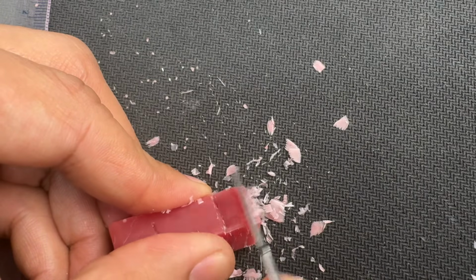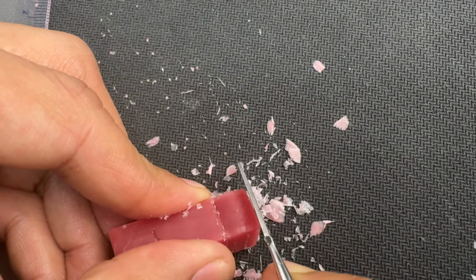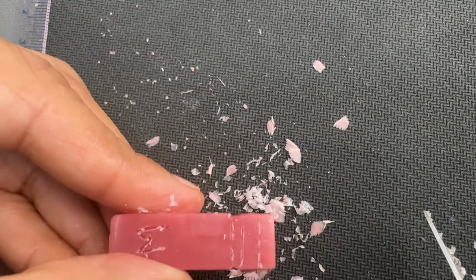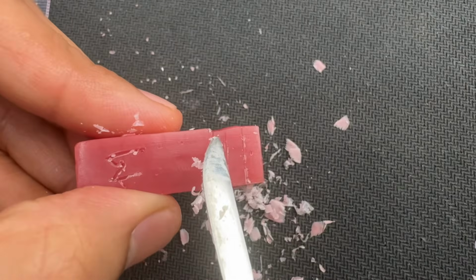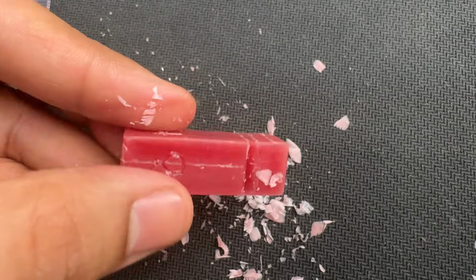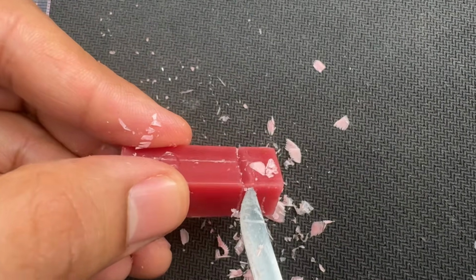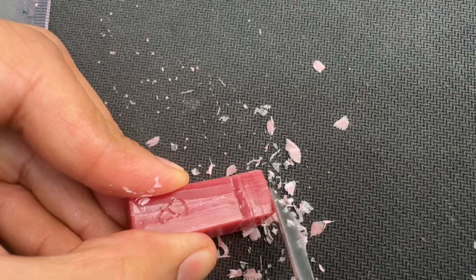As you do, make sure the surfaces are smooth and even and don't create any concavities. You see the crest of curvature? You can see the curve, and the highest point on the curve is middle of middle 1/3. Similarly, if I see the buccal side, the crest of curvature is here. You can make it smoother.